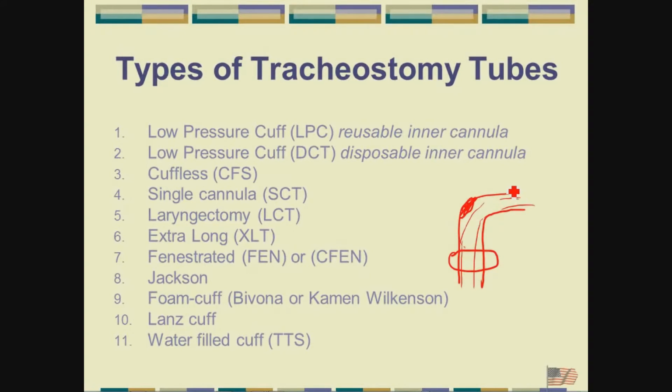There's tubes that have extra length here or here. So if I have somebody who has an extremely large neck, a standard trach tube may not have enough give in this distance between here and the outside. So I can get one with a longer curvature there. I can also get one that's got a longer curvature here. So if I create a tracheoesophageal fistula here, or have some tracheal malacia here, I just put a longer tube in, and I could bypass that in the process.